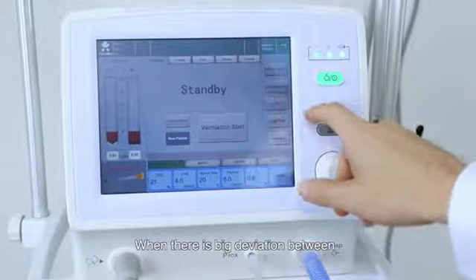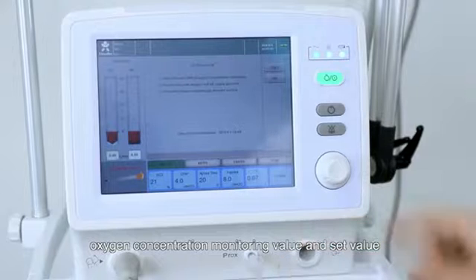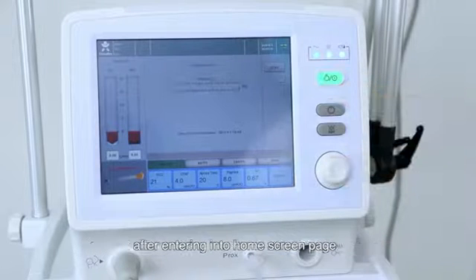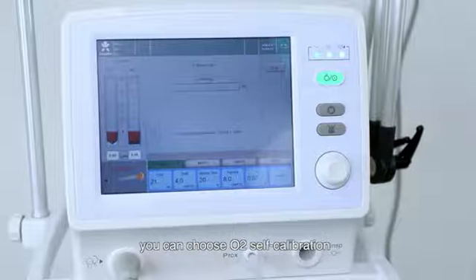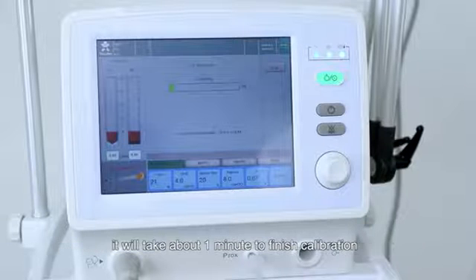Maintenance and care in clinical use. Oxygen concentration calibration. When there is a big deviation between oxygen concentration monitoring value and set value, after entering into home screen page, you can choose oxygen self-calibration. During calibration, the breathing circuits should be disconnected. It will take about 1 minute to finish calibration.